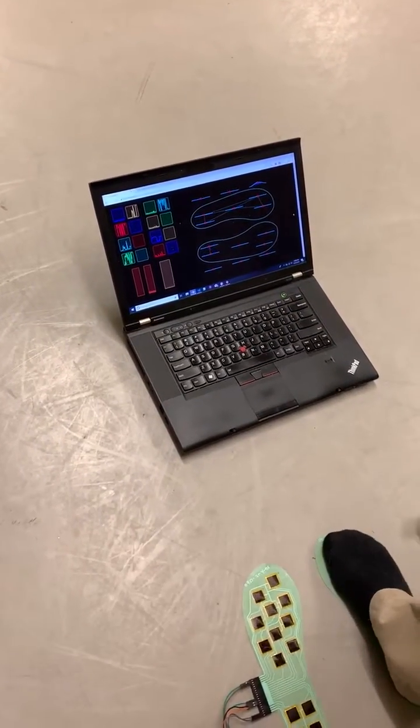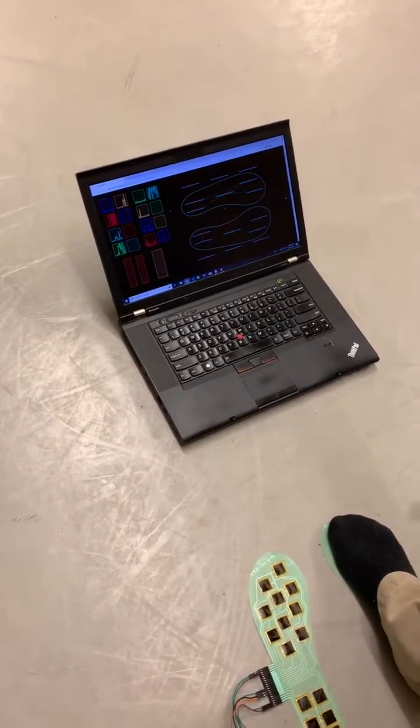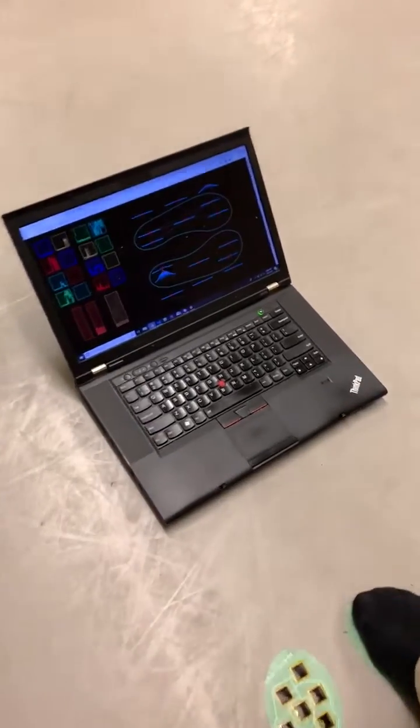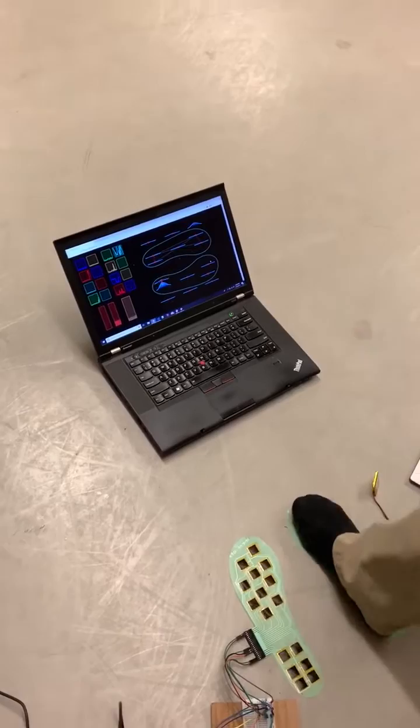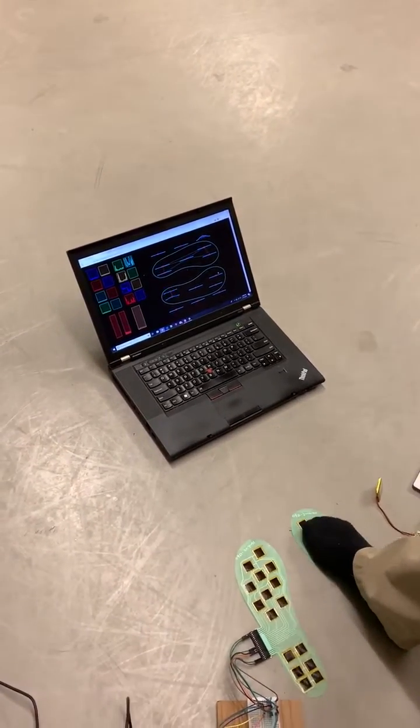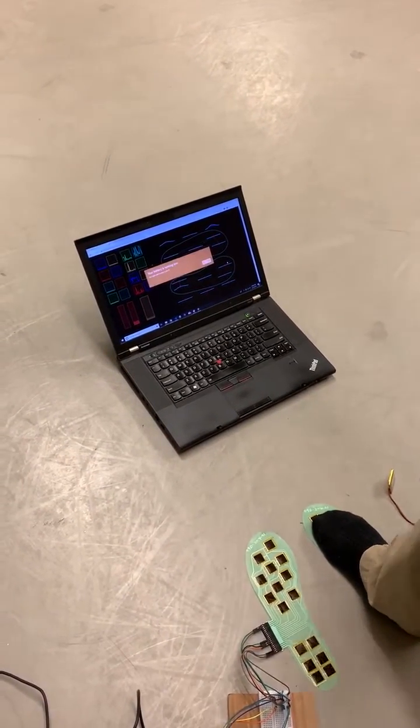Also, as you can see with this foot, the graph is wrong because there was an unexpected difference in the number of sensors that the newest prototype has. So I'll get to working around that soon.